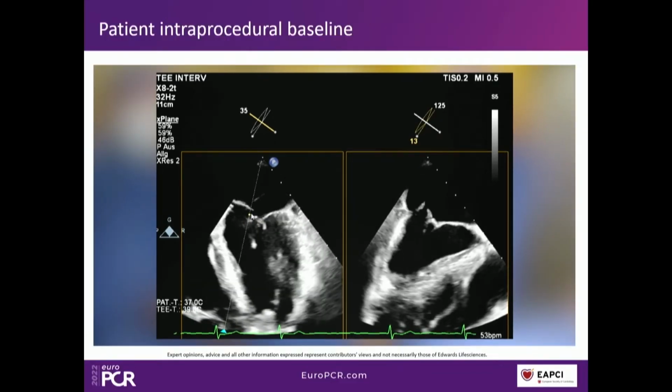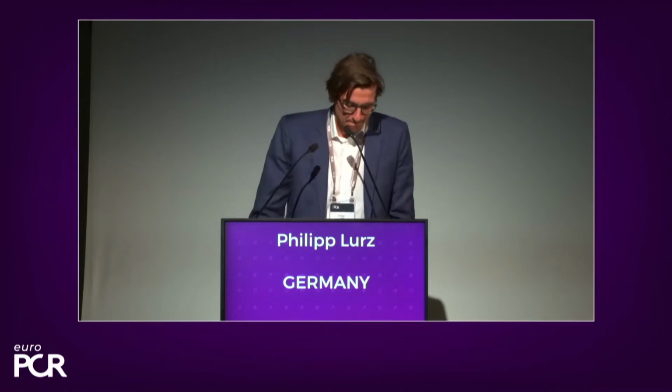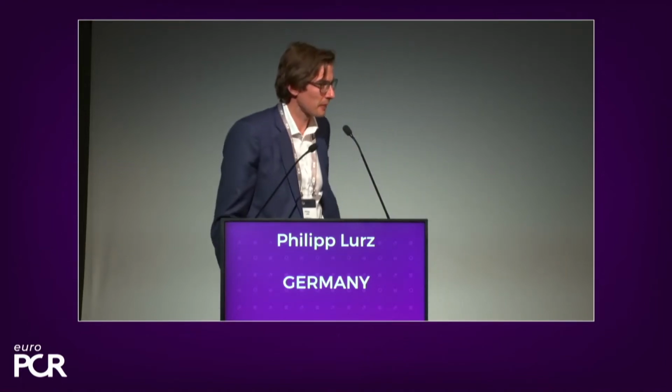Yeah, comments. Any comments from the panel? Still the same, tough case? But the good thing is that you have tissue. I think the cases where you don't have tissue are the worst cases.